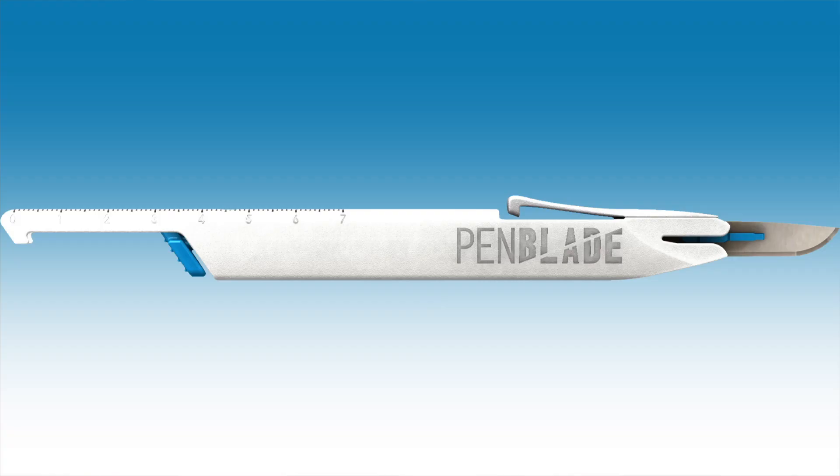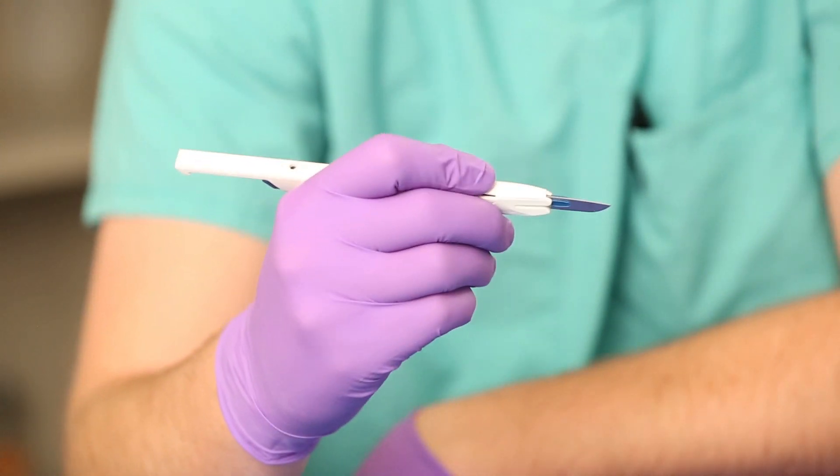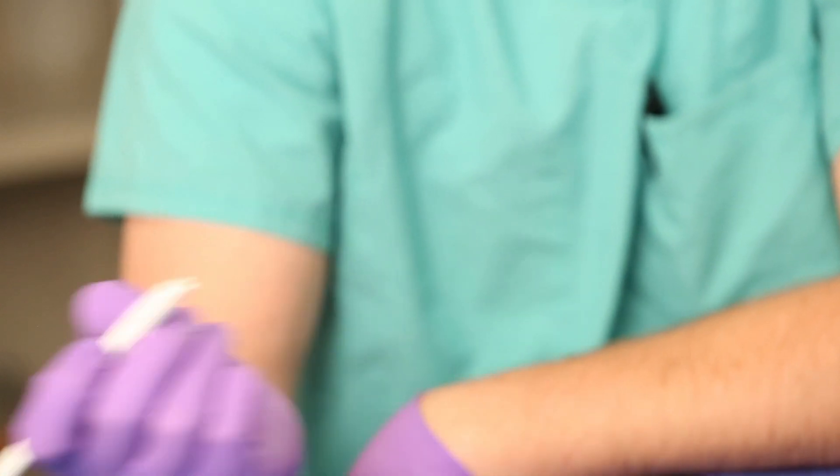Additionally, there are no safety covers or sheaths. Contrast that with the PenBlade. Activation is intuitive. Retraction is simple and convenient — and no look. This encourages safe retraction of the blade in the operating room, reducing the risk of injuries for technicians and others assisting with surgery.